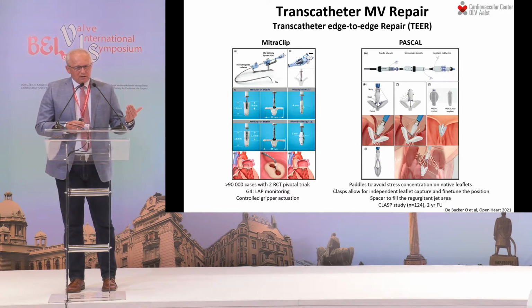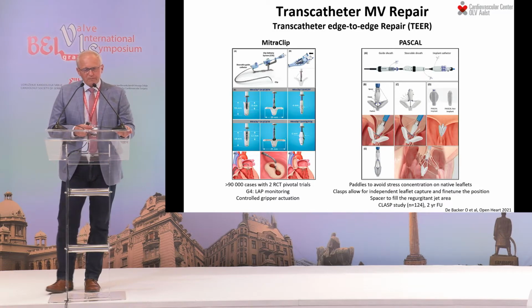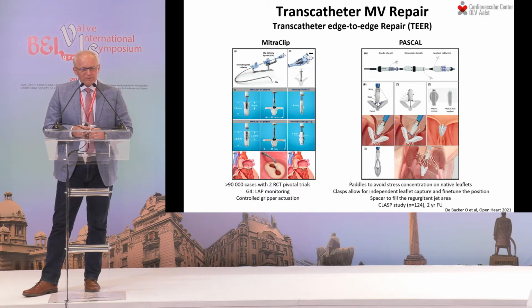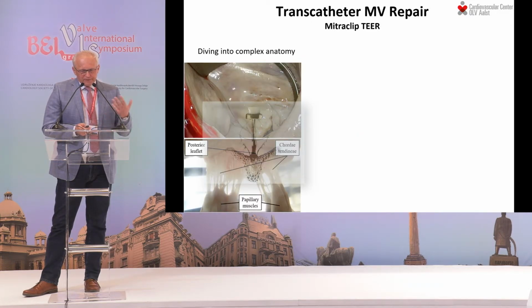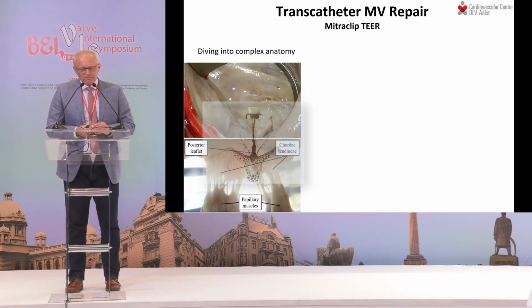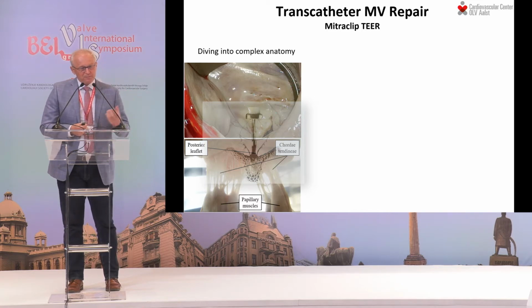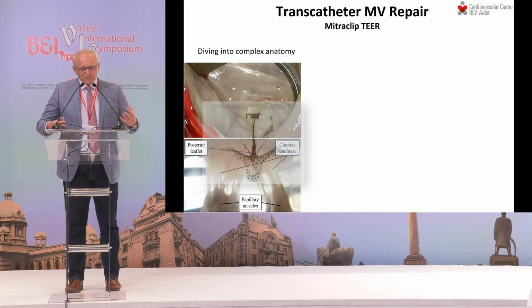In the next slide, I would like to dive deeper into the still hot topic of use and adoption of the MitraClip in clinical practice. So basically, it always comes down to how easy, how adoptable this technology is, when you think about this simple device with maybe robust, difficult manipulations diving into the complex anatomy.